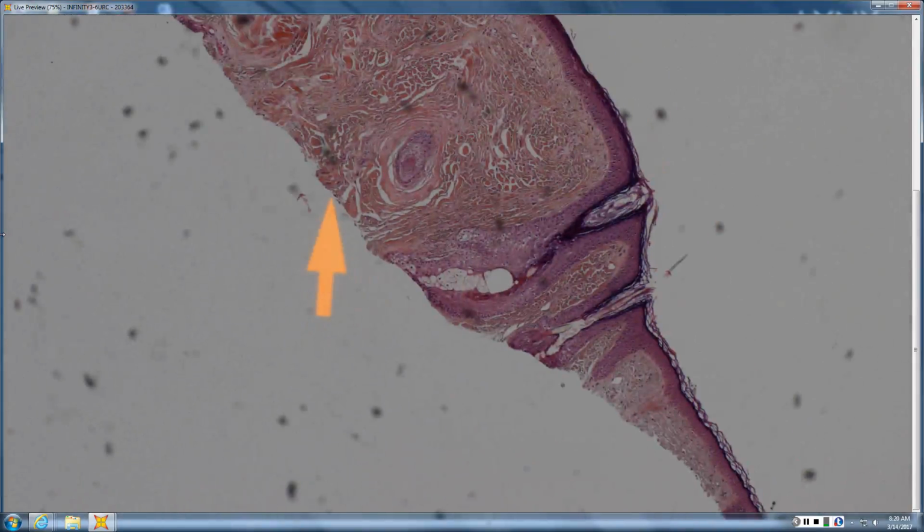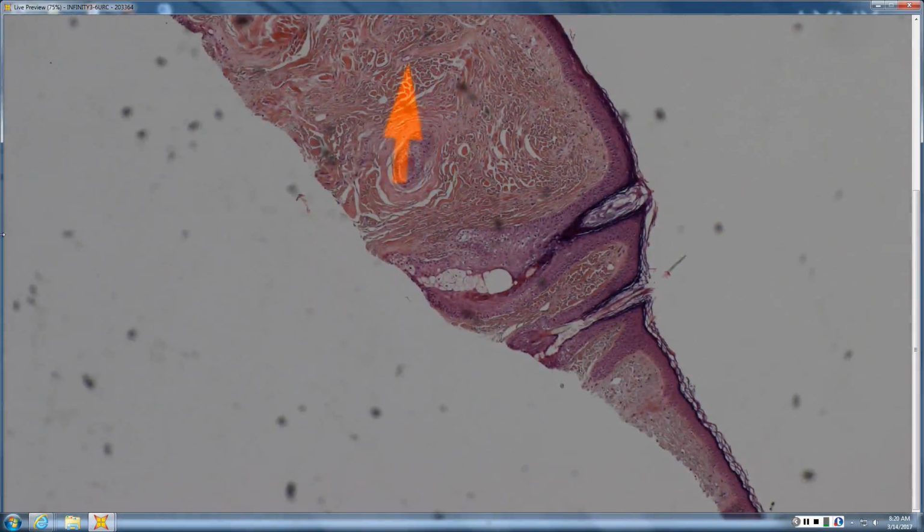Very focal papule here. Little focal papule composed of collagen. It definitely has collagen. Almost little itty bitty collagen balls. It doesn't have the overlying acanthosis or follicular induction surrounding it, though. Any pattern to the collagen around pre-existing structures like vessels or adnexal structures? Kind of onion skinning. So what might this little papule that looks like it's on facial skin be? Fibrous papule. Like a fibrous papule.